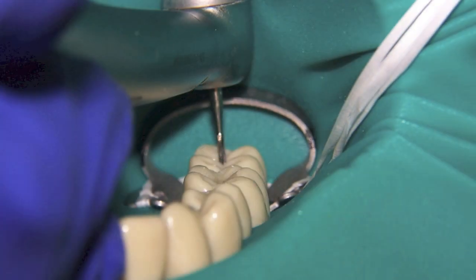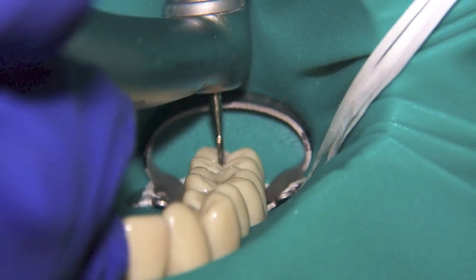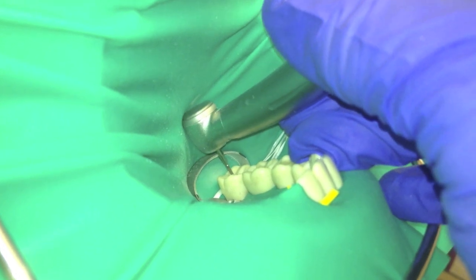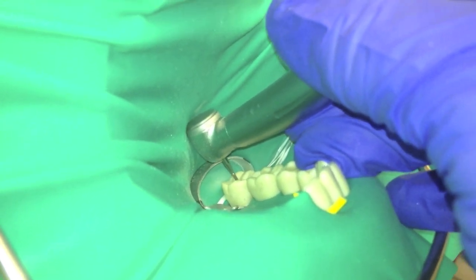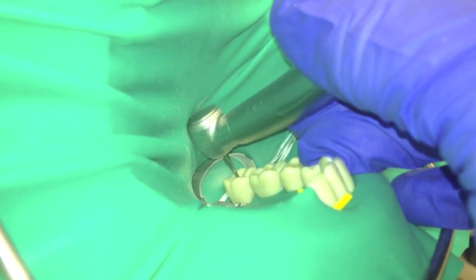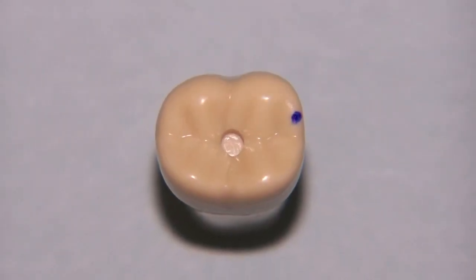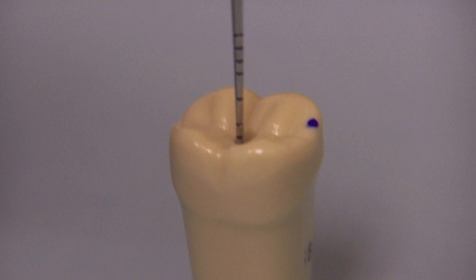The initial cut is placed in the central pit. Light circular movements are used to create the initial cut. The ideal depth is measured at 1.5 millimeters from the shallowest point.